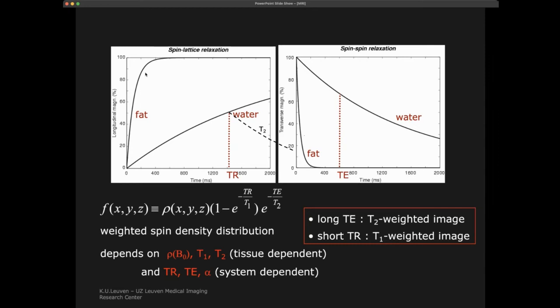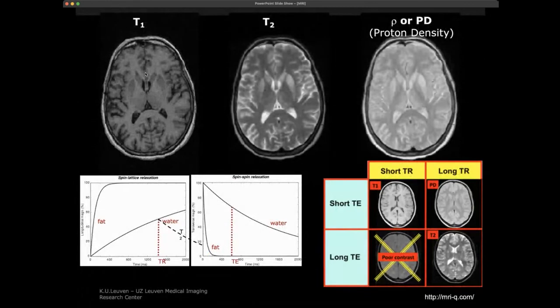That's what we look at. These are the most extremes in some ways in our soft tissues. But keep in mind that the soft tissues, for example gray matter and white matter, also have a slightly different combination, and this will show a different amplitude. And here you see the effect of it.